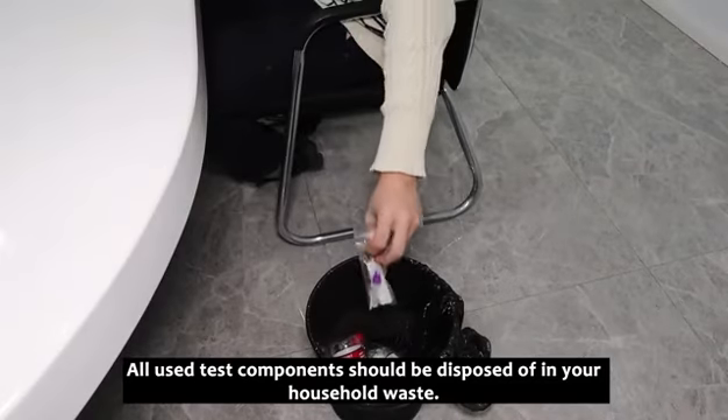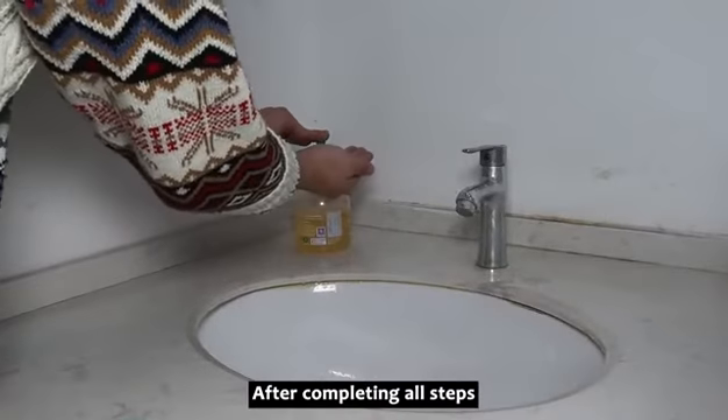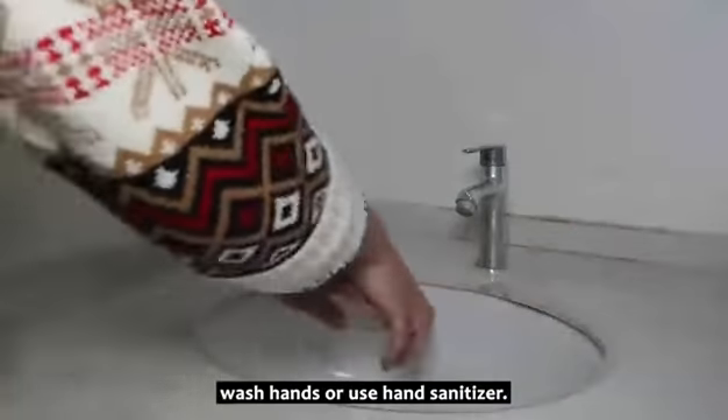All used test components should be disposed of in your household waste. After completing all steps, wash hands or use hand sanitizer.